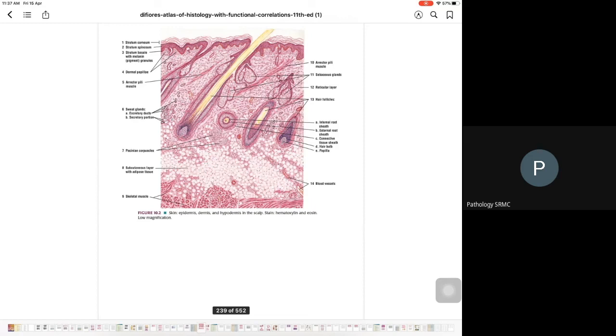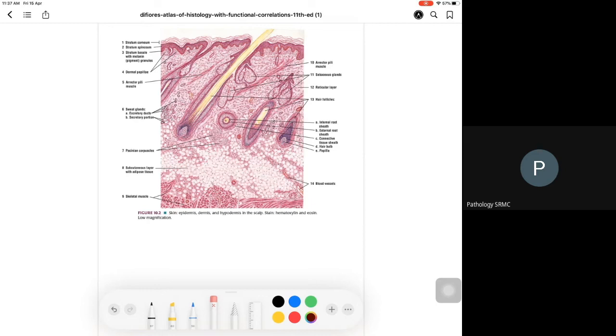And remember, in the epidermis, what are all the layers we saw on that day, Abhijit? Yes, sir. Stratum basale, dark blue cells. So this is stratum spinosum. Stratum spinosum forms the major portion of the epidermis. Above that, there are some cells with granular pigment, so then it is stratum granulosum. And above that are very flat cells with keratin, known as stratum corneum. There are 4 layers: stratum basale, stratum spinosum, stratum granulosum, and stratum corneum.